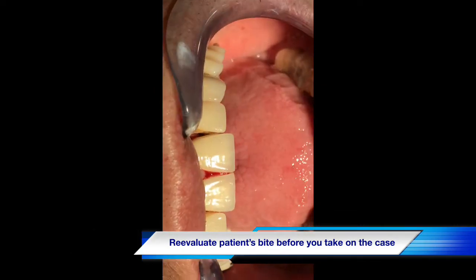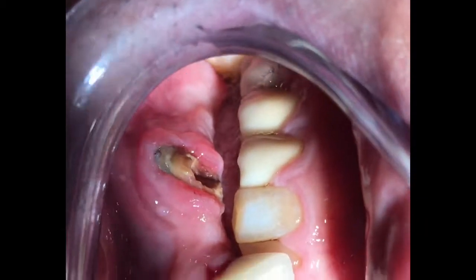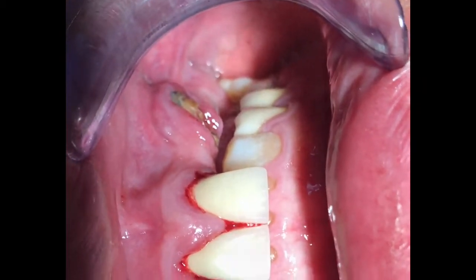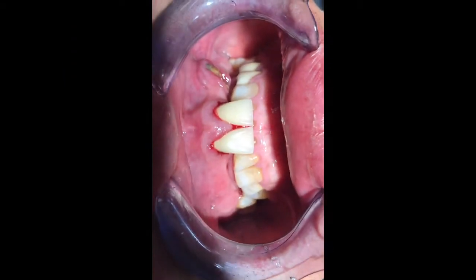The deep bite is one of the reasons why the canine will knock out. Tooth number 11 in this particular case has recurrent decay, which is why when the patient was eating something hard, it broke — so that tooth needs to be removed.